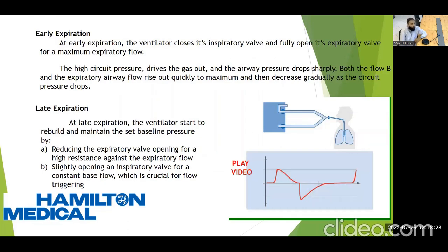So early expiry time, what are the phenomena of early expiry time? Basically, I want to say what happens in the ventilator to manage PEEP or to manage ventilation in the expiratory phase. It is very important to understand the concept of the expiratory phase, because we have been gradually discussing the controls and the triggering related to the inspiratory phase. But it is important to understand what happens in the expiratory phase in the ventilator and in lung mechanics.